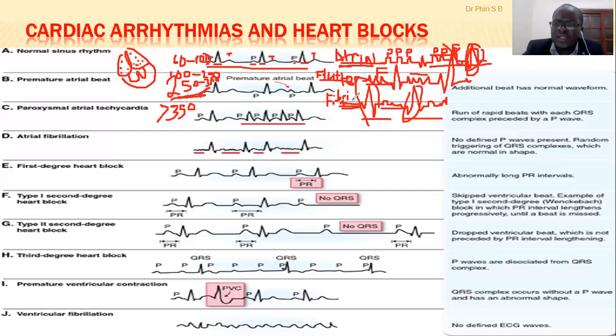In this case, the heart is misbehaving. So how can you stop these fibrillation or flutter waves? This is where you can use a defibrillator. It's a kind of machine that looks like flat pads with electricity. The defibrillator doesn't stimulate activity within the heart.